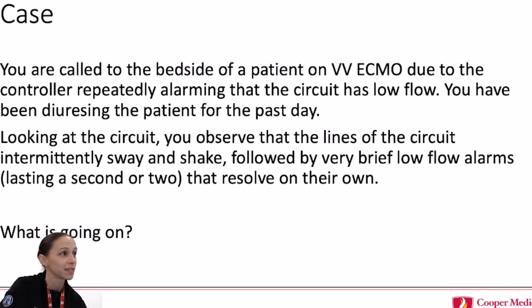Very good. We see that when the sweep gas is totally off, no oxygen going to it, or if there was a malfunction or the oxygen source was out, you would see both very dark blood. So it's a quick visual you want to look at when you go in the room. Okay, I see color change, dark venous to bright red. Okay, I know that oxygenation is happening.